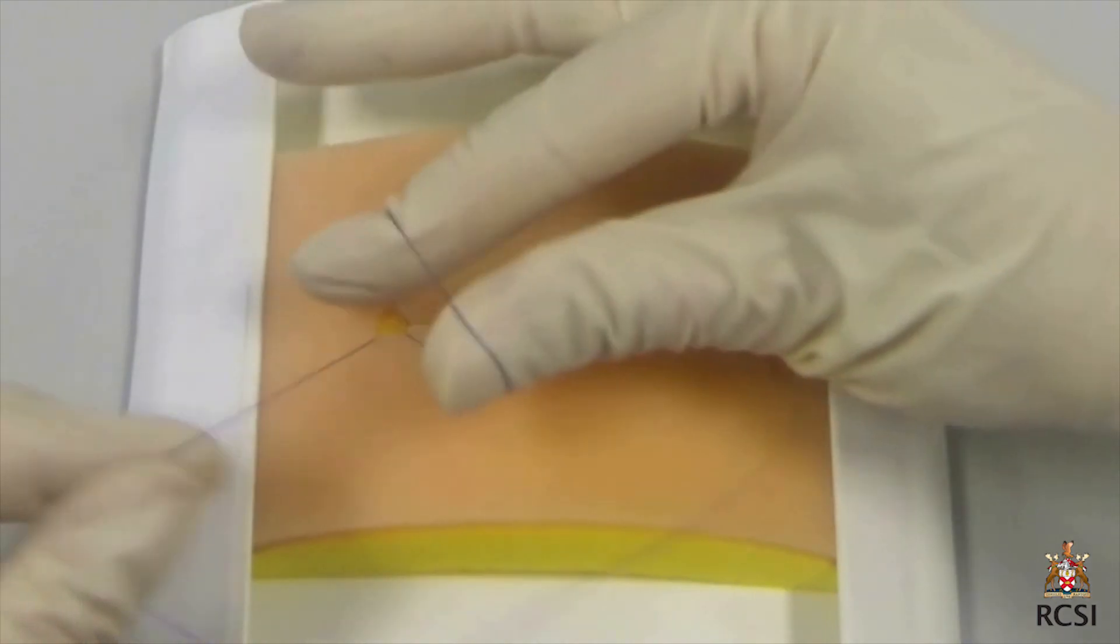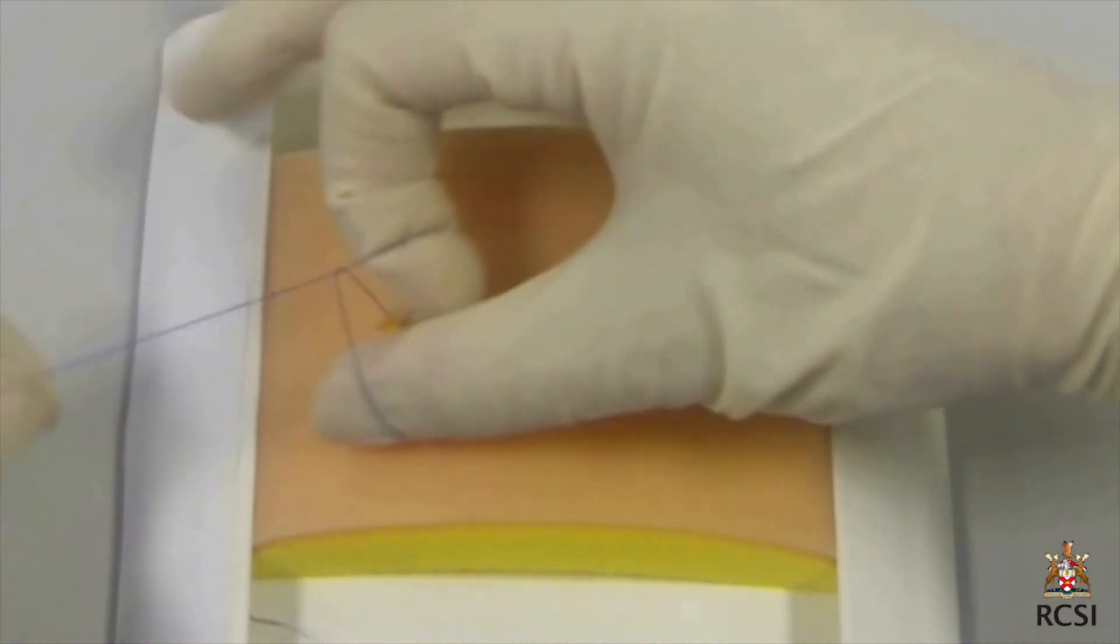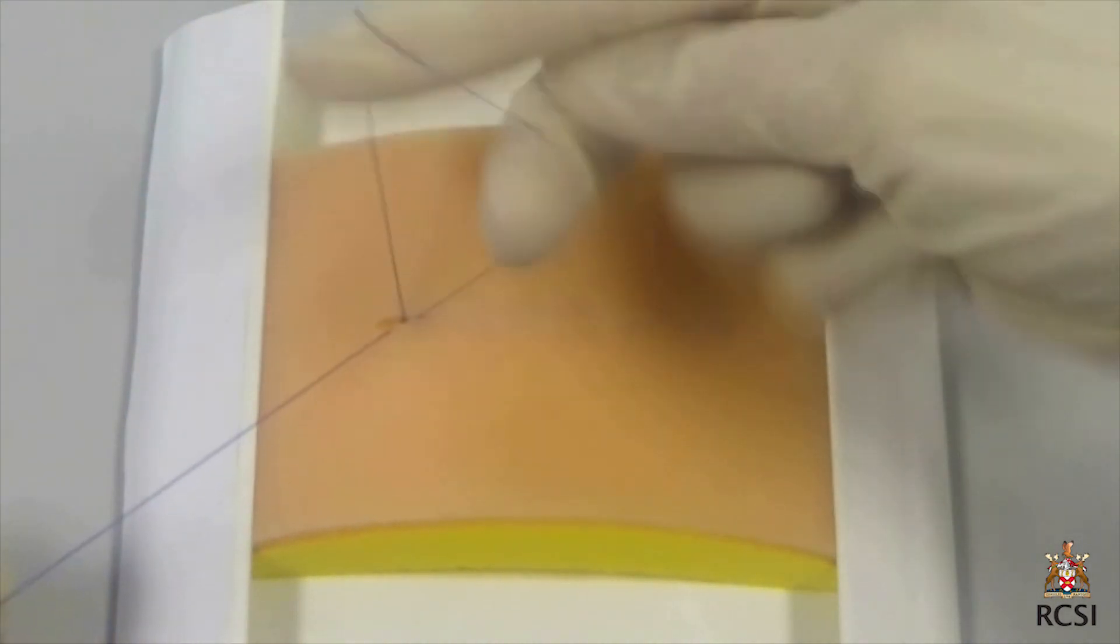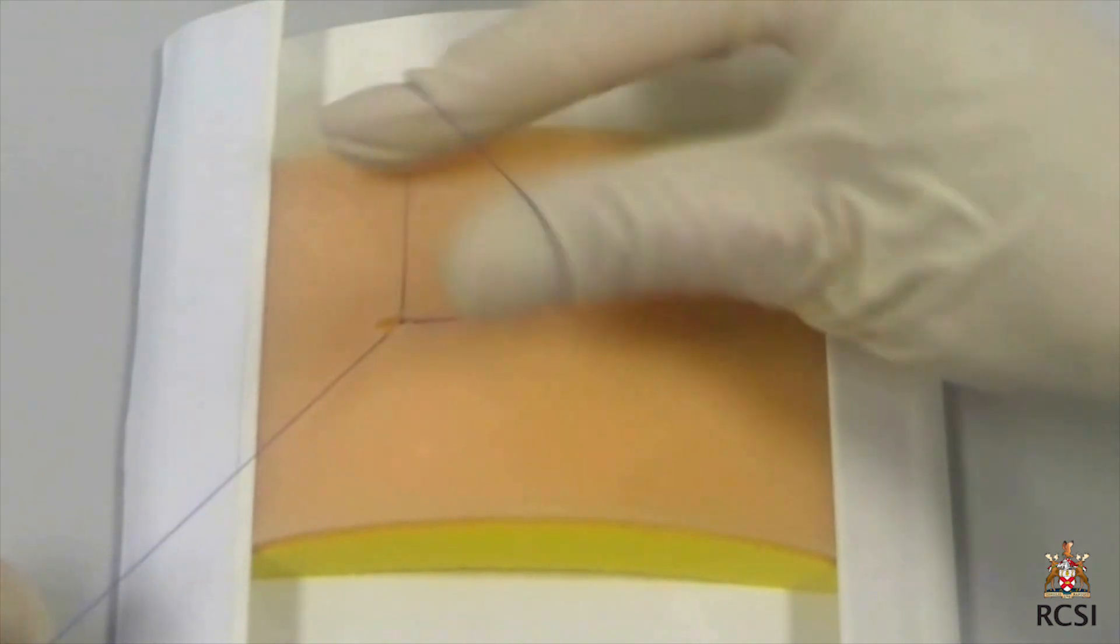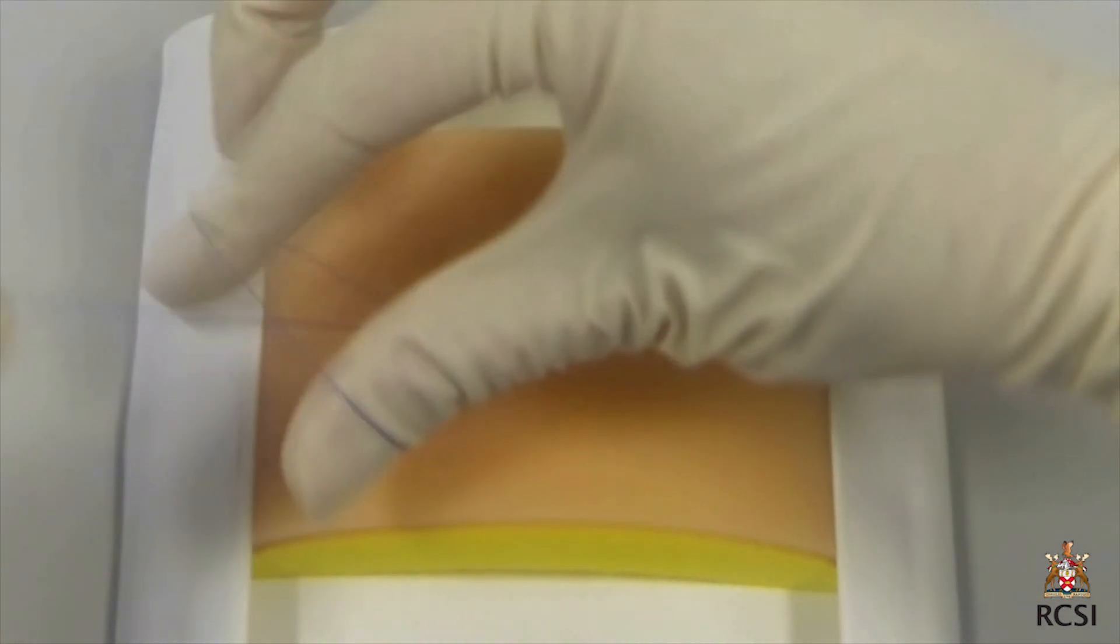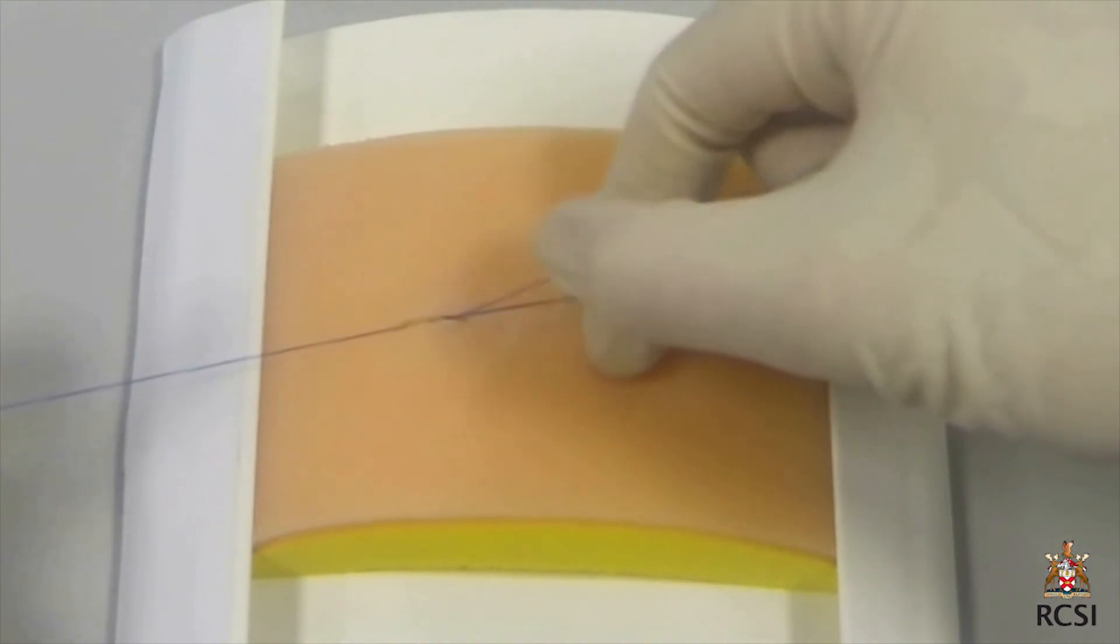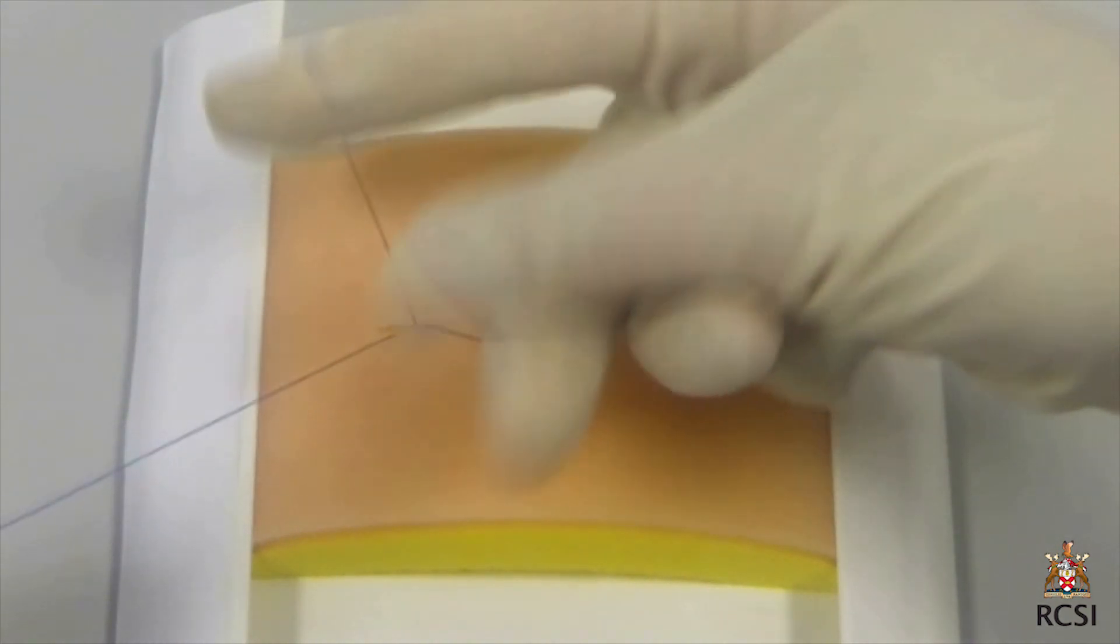The thumb and the index finger are inserted into this loop with the right hand. Then, while holding the long end with the left hand firmly, the long end is grasped with the right index and thumb and pulled partially through the loop. This is tightened to form another loop.